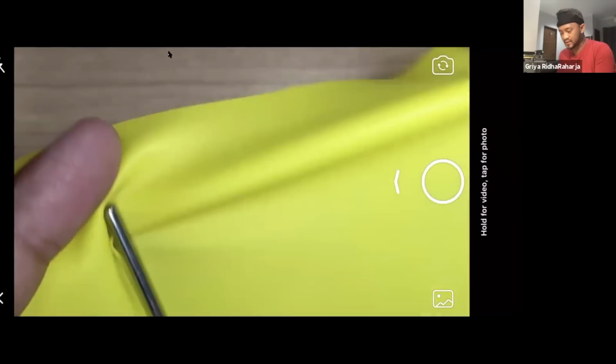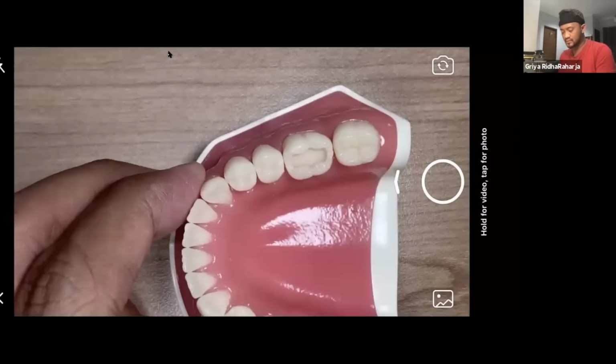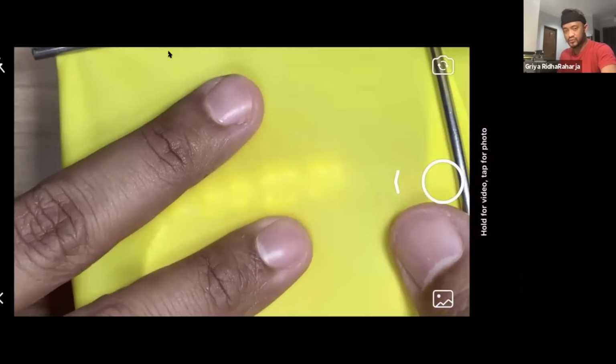Okay, so let's mark again. Push like this. Maybe in the real situation, it will be like this.